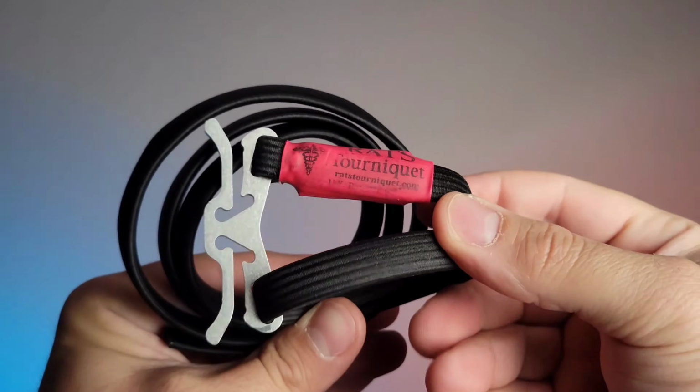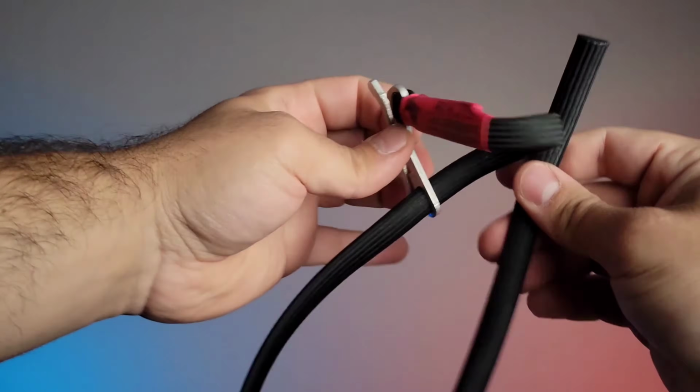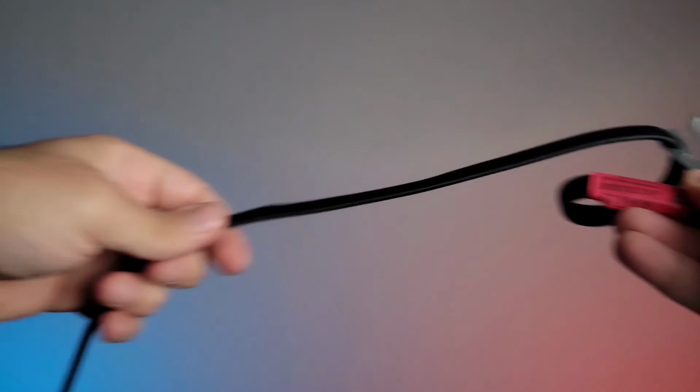Now, even for the size, although it is somewhat easier to wrap around, for a long time what I was actually doing with this is wrapping it around my belt line, so it almost acted like a secondary belt, not for holding my pants up, but as the secret concealable way to have it wrapped around your body. In that way, it was still much easier to carry than these other options. But the question is if it was still sacrificing functionality for what a tourniquet was supposed to be.